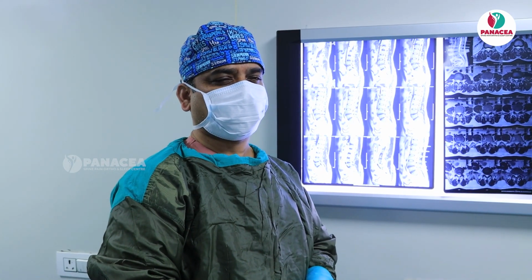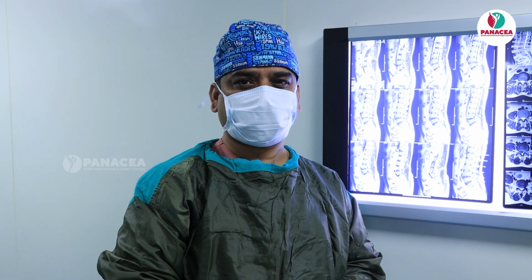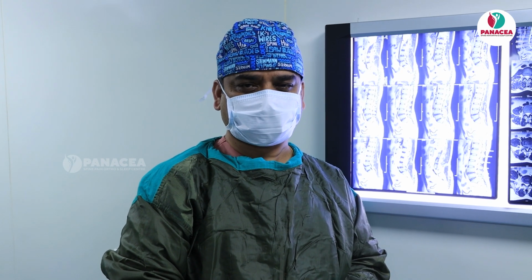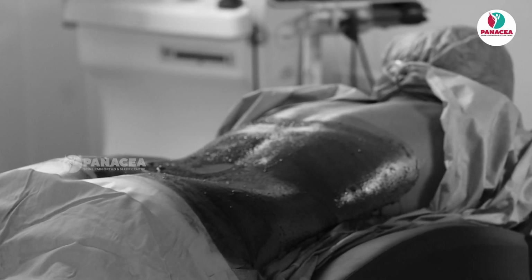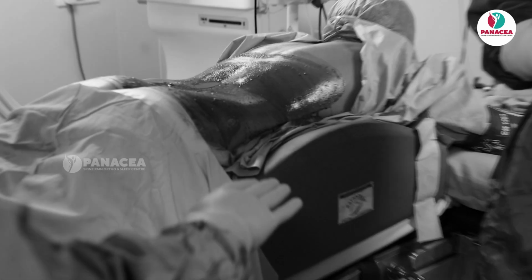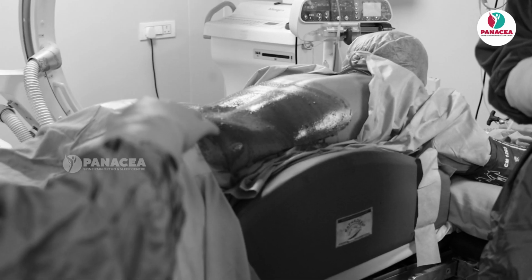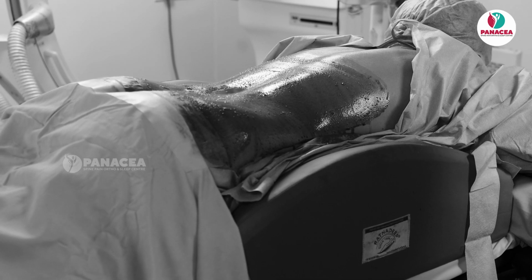I am going to stand on the patient's right side. I will show you how we are going to scrub the patient, and I am also going to tell you about the positioning of the patient. Now the patient is positioned prone. You can see a pillow, it's almost like a Wilson frame, but it has a soft cushion. There is a hole in the center to accommodate the abdomen so that there is not much IVC obstruction.